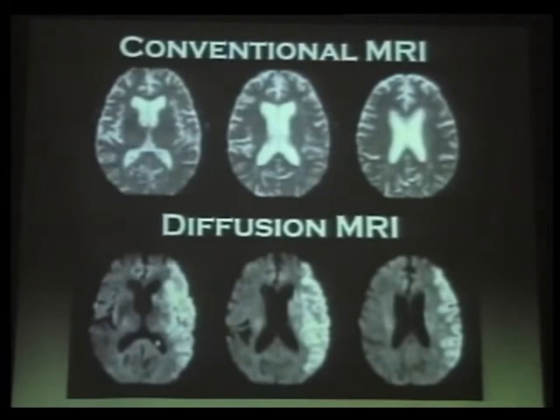In the U.S., DWI is quickly becoming the standard of care for stroke and for all MRs. Whether you want DWI or not, you get it. But at some places, you have to order it.